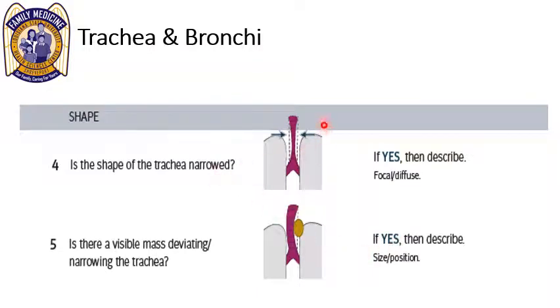So if there's narrowing of the trachea, like laryngomalacia, then you might have some other issues going on, especially with our youth that may experience this. In addition, people who are post-op from tracheal or bronchial injuries may also have that. Again, you can also have mass effect from this. Is there a visible mass itself? If that's the case, well, then we all know where that goes. It's going to go to oncology and surgeon.